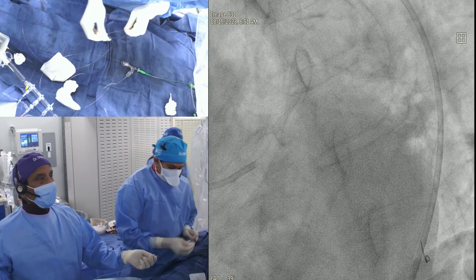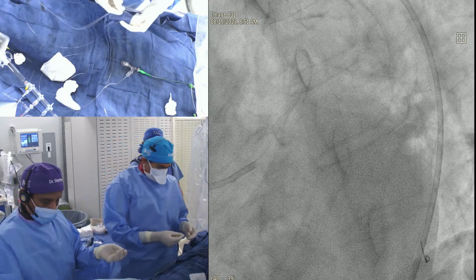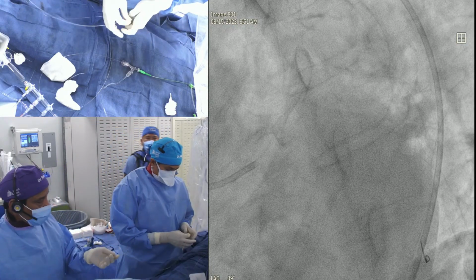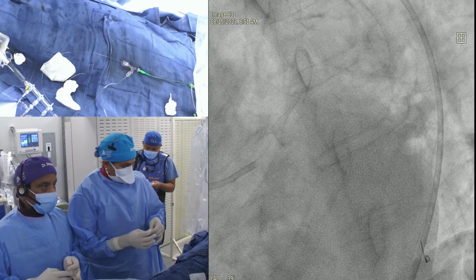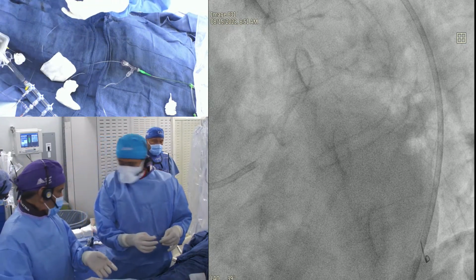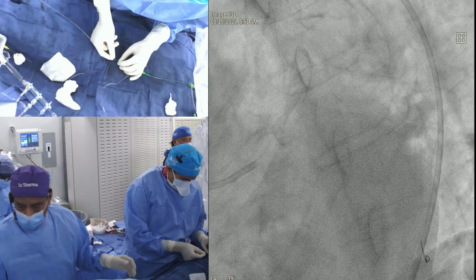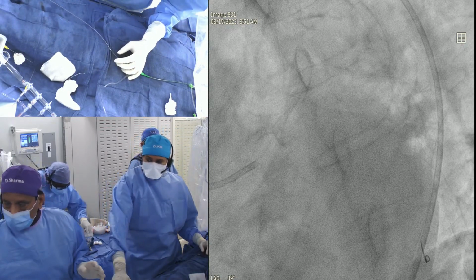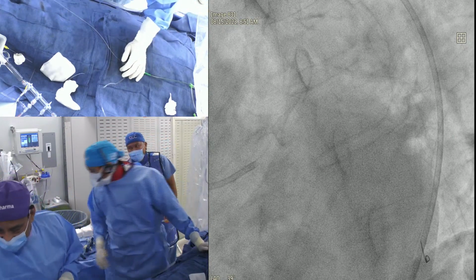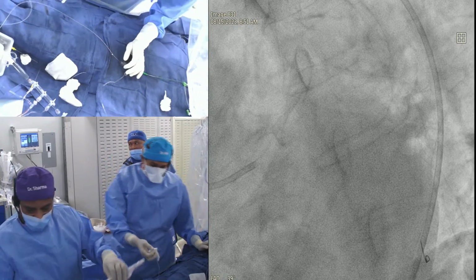Okay, guys, get a balloon ready, 2.5, right? 2.5, 12 or 15 balloon. Frank, do we have a run through already? Yeah. Okay. Is this ready yet? Yep, warmed up. 5 minutes. I told you 5 minutes. Okay. The highest laser user. I had to use a little more laser to understand the timing of getting ready. Good. Okay, 5 minutes.